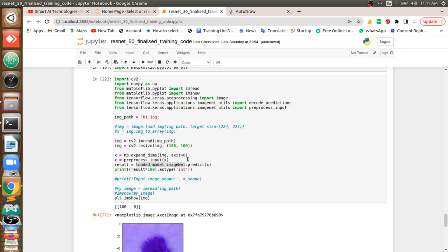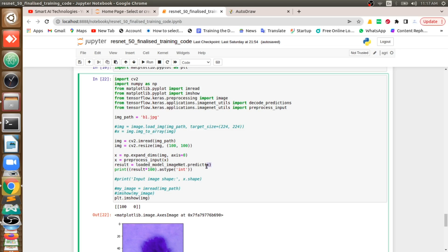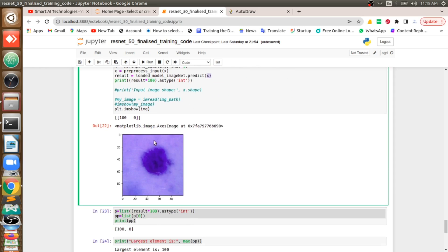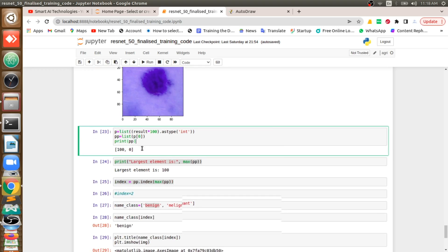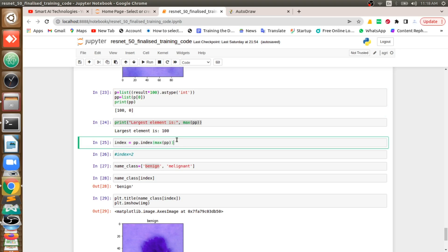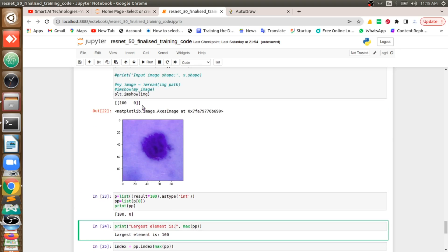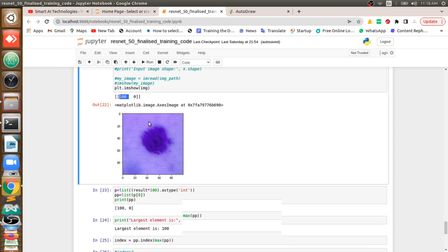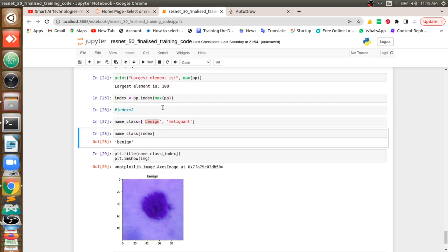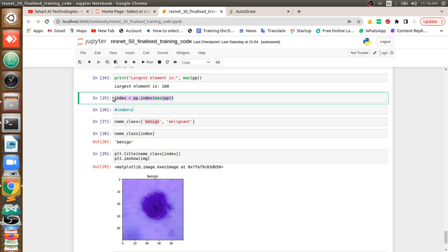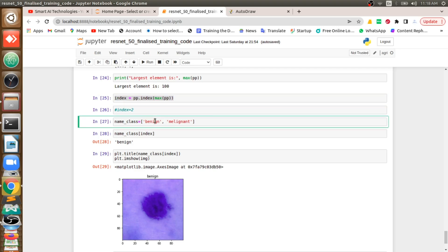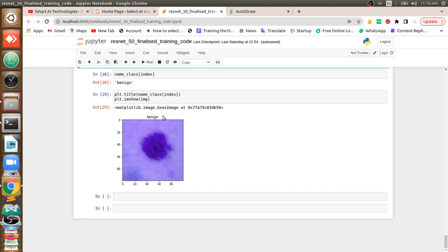I read the image using cv2, feed it to the model as x, and it gives the result array. I display the image and the result. From the array, I take the maximum value — if 99/100 is at index 0, that means benign — and get its index to determine the class, displaying the result accordingly.